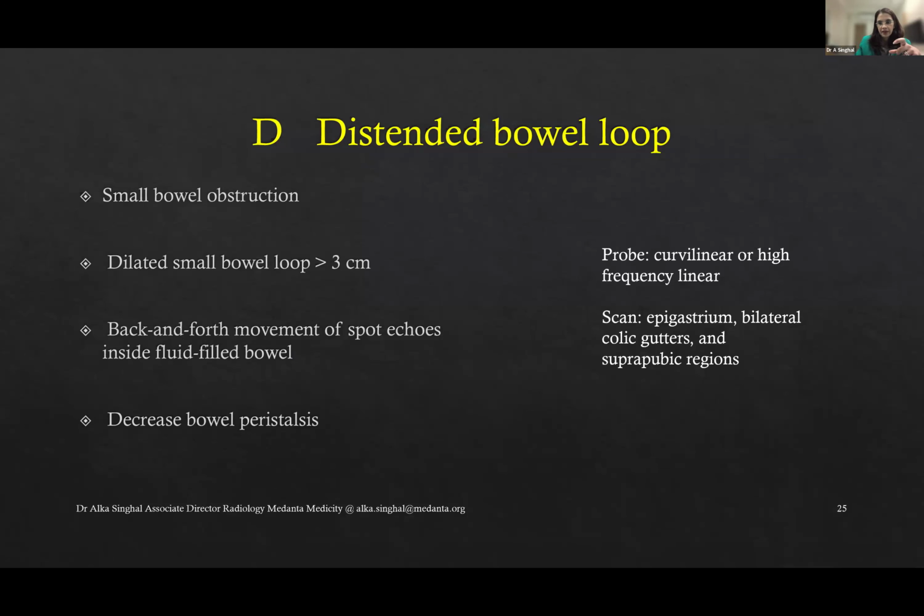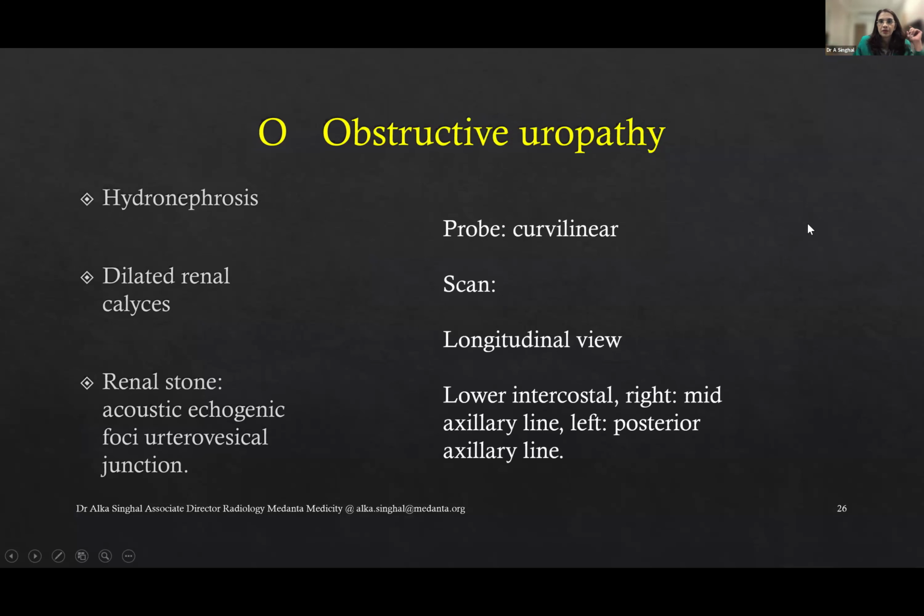meaning, we will learn more in detail when we do intervention. So contents are going and then they are coming back. And of course, there's some stasis or ileus or decreased peristalsis that's also happening. So you look at that, and of course, you will scan all the areas.